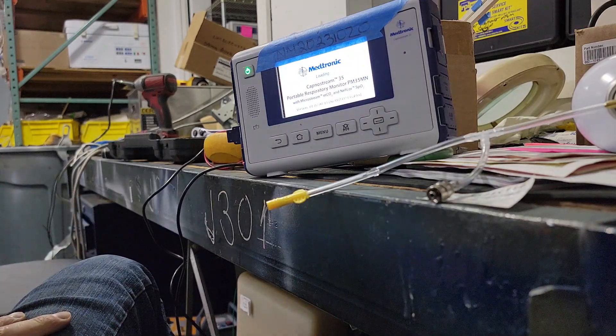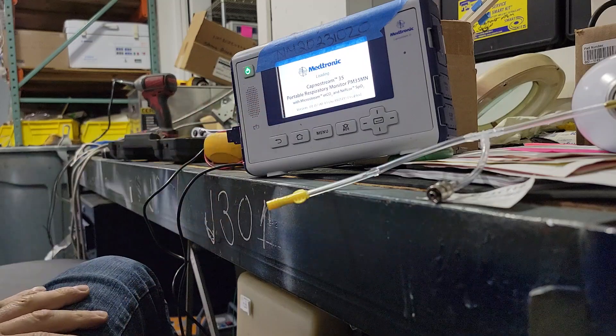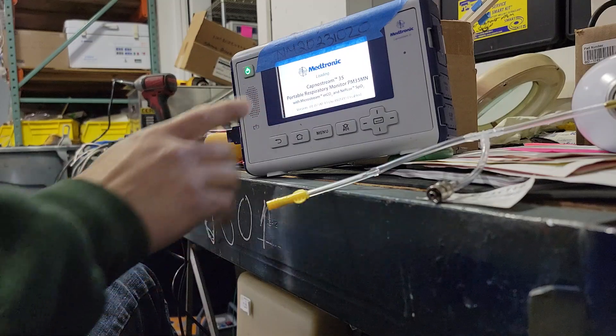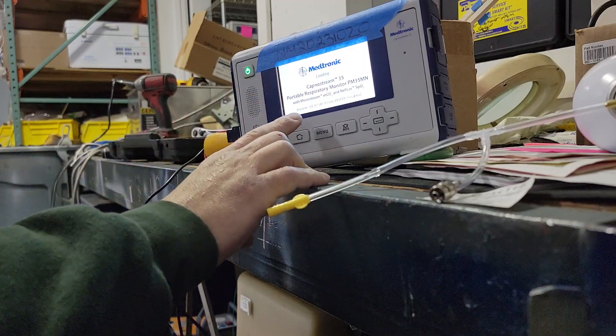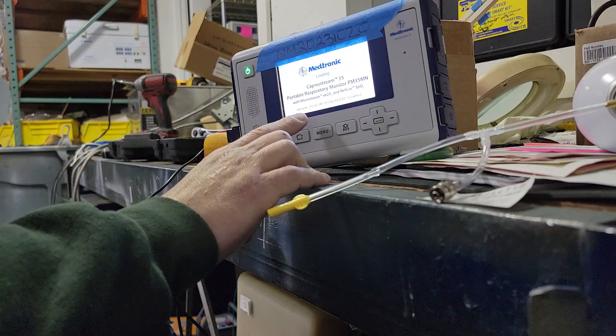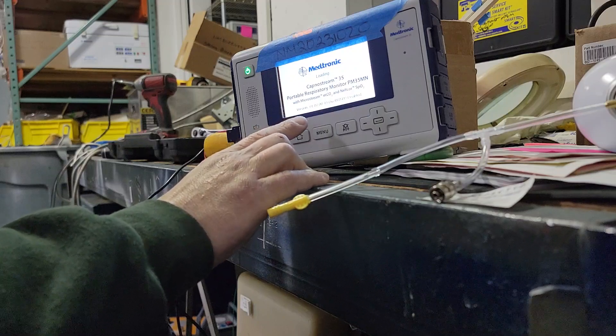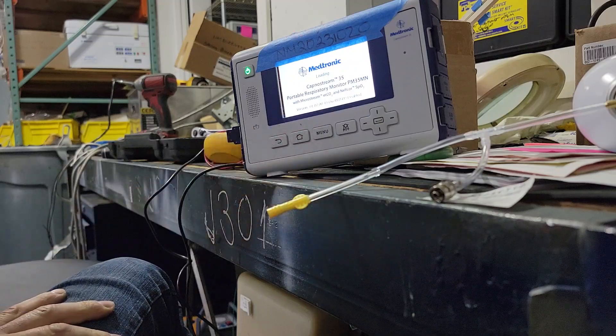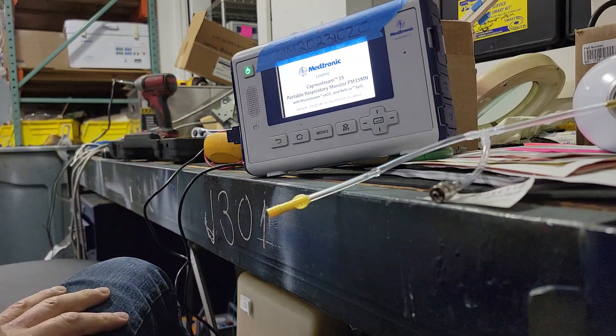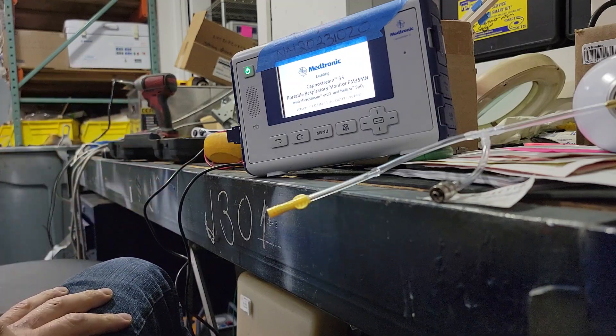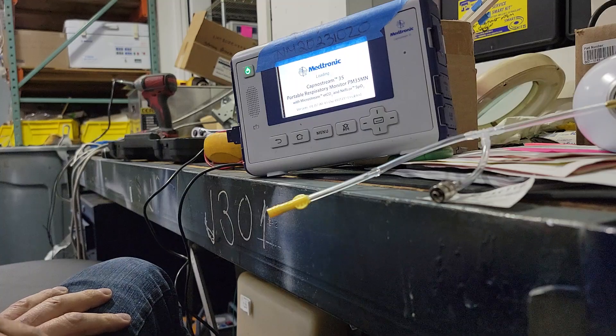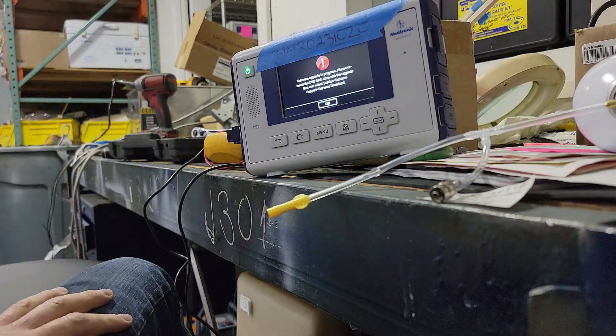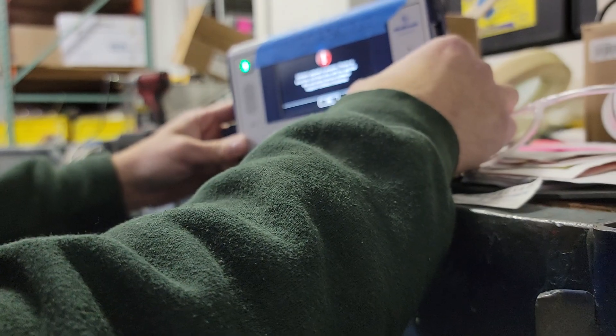Get a software update on it. As of May 1, 2023, software version 01.07.00.43 is the current software. All you need is a USB stick and internet access to go online and download the software. I could show another time how to do that.